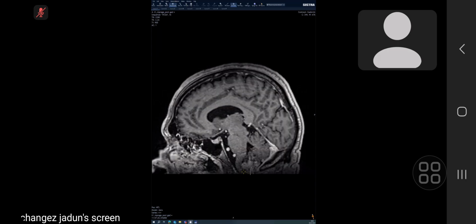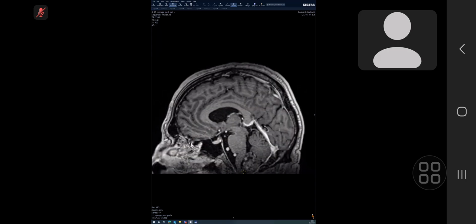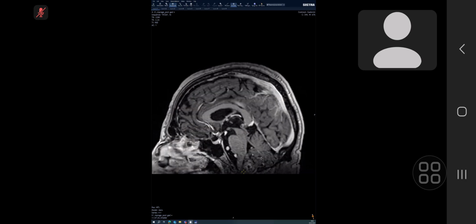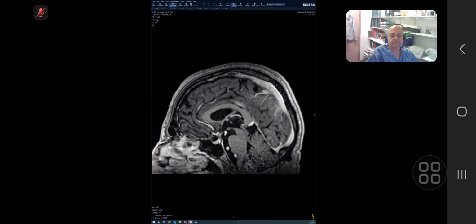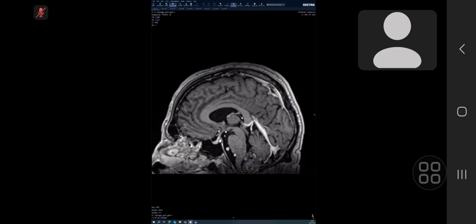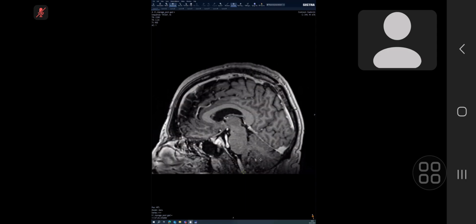The lesion showed few calcifications as well, and seems to be in relation to the inferior portion of the fourth ventricle, and seems insinuating and further going into the foramen magnum and into the upper cervical canal region. Less likely a meningioma, because I can't see a proper enhancing dural tail, and the T2 signal was also not looking like that of meningioma to me, although it had calcifications.